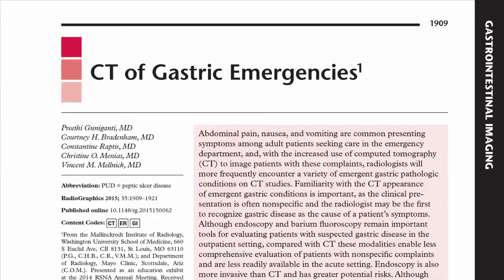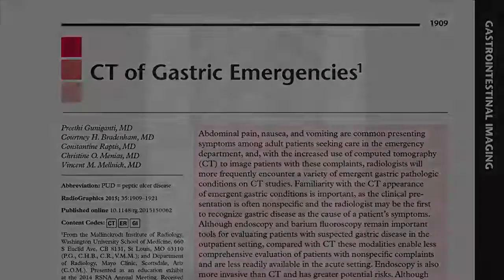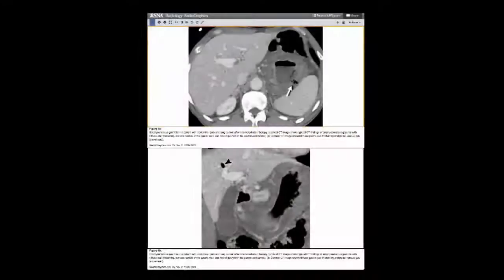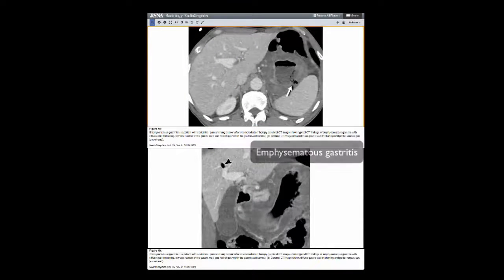Inflammatory conditions, obstruction, perforation, hemorrhage, and ischemia can be detected on abdominal CT in some of these patients.